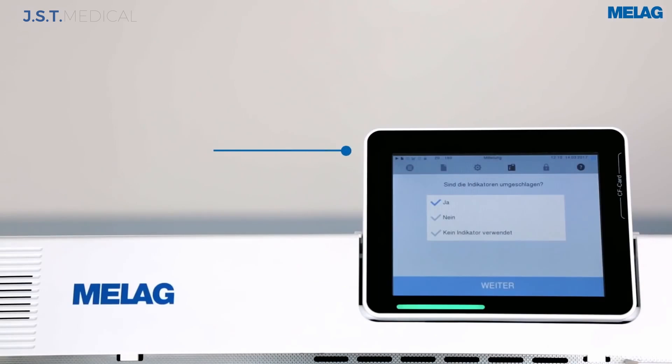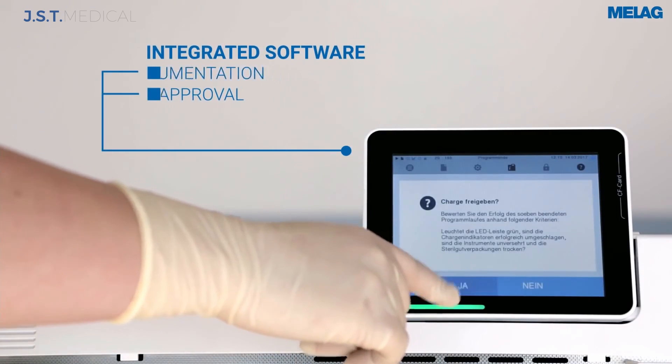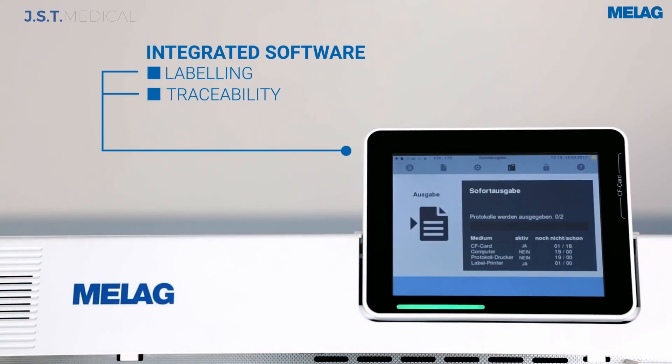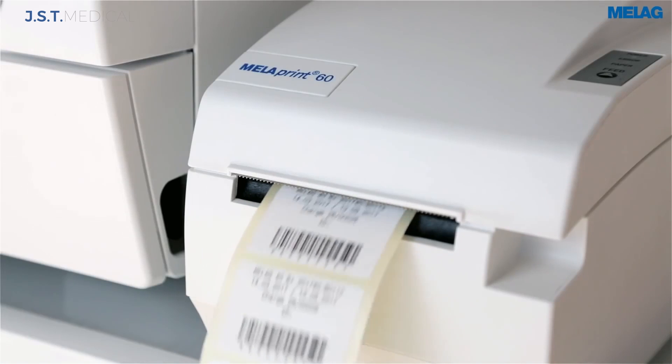Operators can log in to start and release loads for documented batch approval. Add a barcode label printer and the track and tracing chairside becomes quick and easy. Connect up to three autoclaves to one printer through your own network or a small hub.